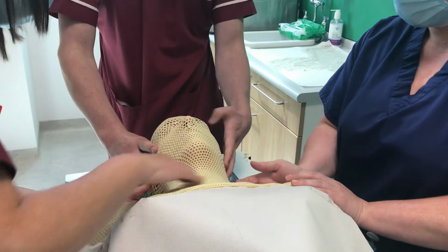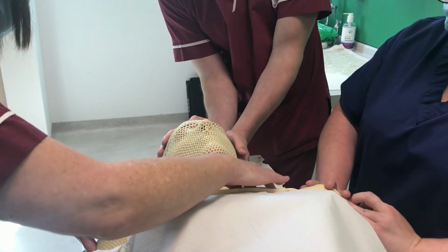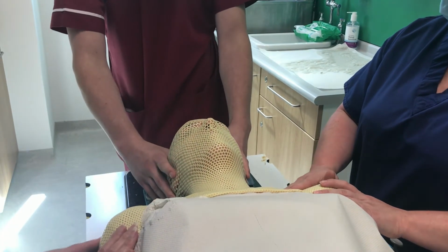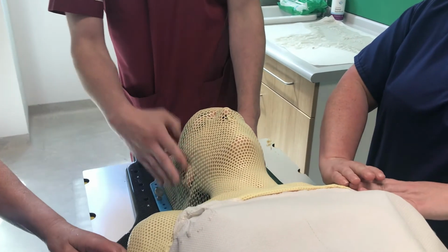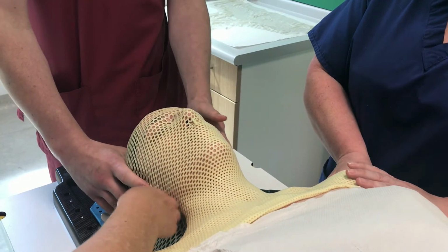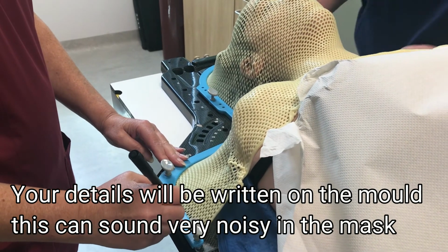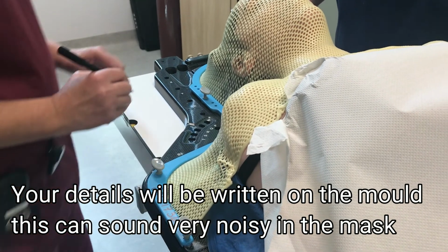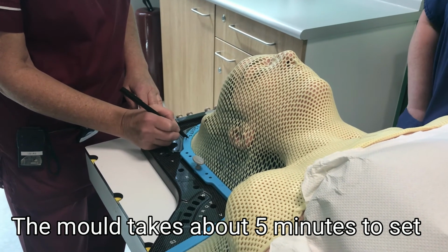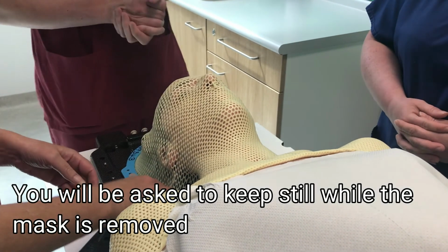So the top section is setting beautifully, and the edges do take a couple of minutes longer. Just be mindful on your chest to keep it as relaxed into the bed as possible. As we said, our apologies for the prodding and poking. Just breathe away normally. Okay, you're doing brilliant. The setting in itself takes probably about 5 minutes in all. So we're getting there. If you keep still, then we won't catch anything, and we won't have any bumps.